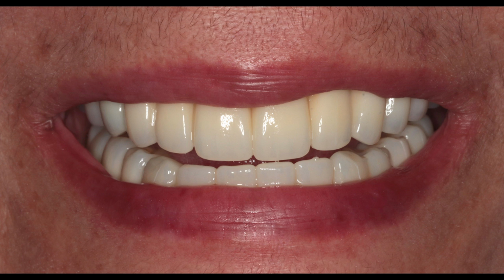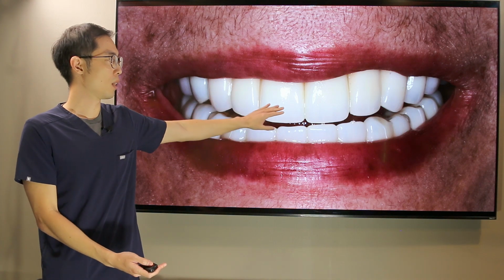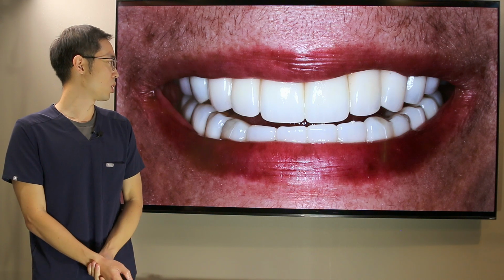And this is a final smile. Really natural looking. You can also appreciate that the teeth have a bit of translucency at the bottom edges of the teeth, and I think the patient was delighted at this outcome, and so are we.